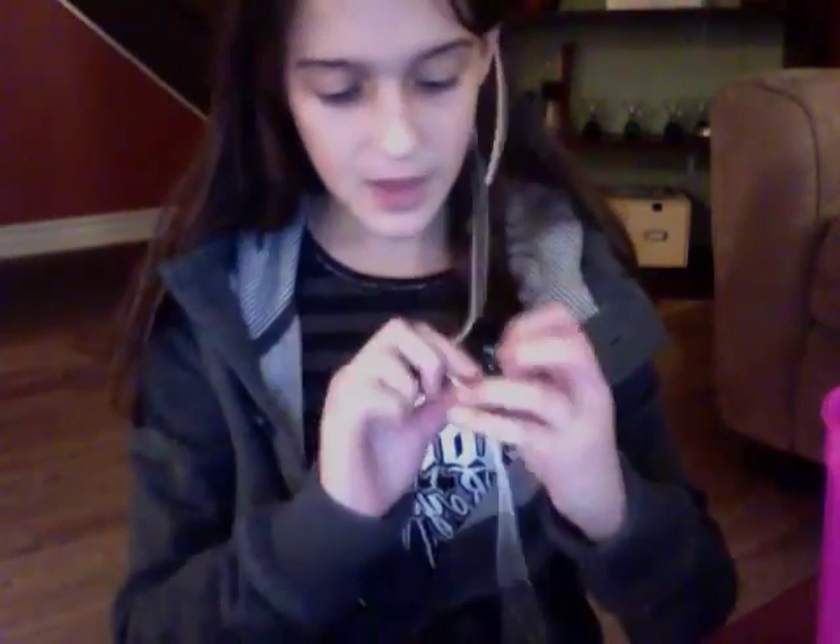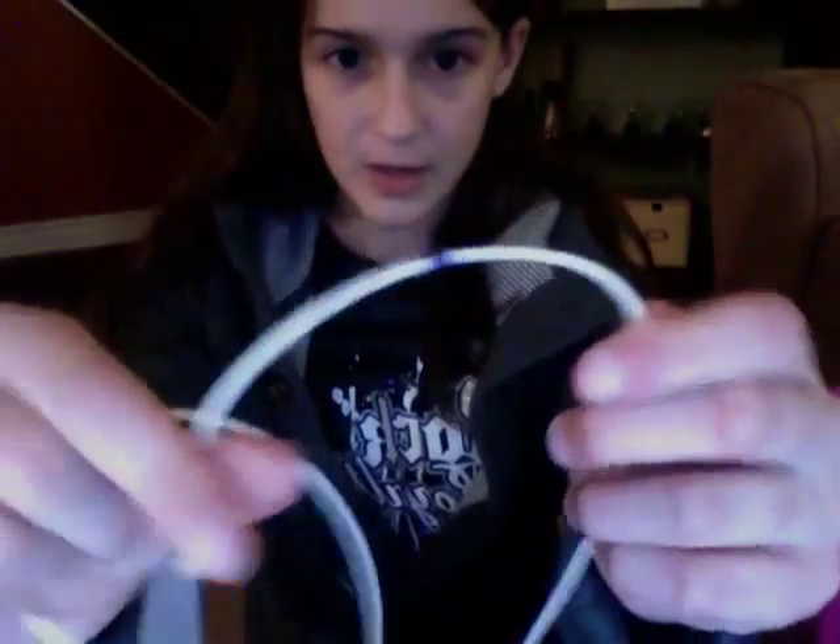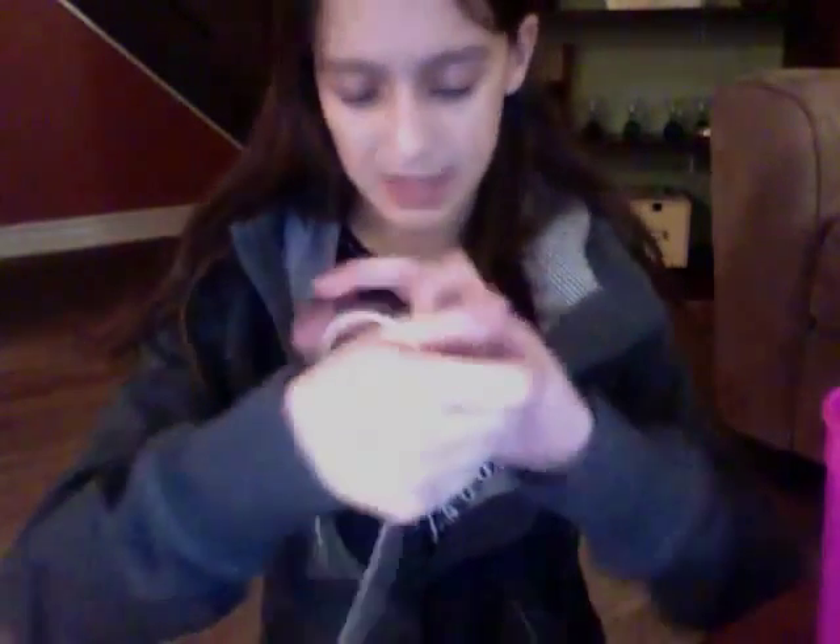First, you have to measure the tube. Put it up to your nose, put it behind your ear, and find your sternum — that's the bone right here. If you have small fingers, find the sternum and go one, two, three fingers down, then pinch and mark it there. If you have big fingers, use two fingers. I marked it with a sharpie — just make it a color that stands out from the tube.